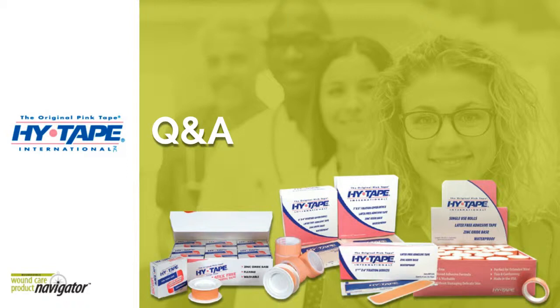Should HyTape be used with ostomy products that are able to adhere to skin on their own? Well, in a lot of cases, it's not necessarily needed, but in some cases where exercise or activity or even swimming is going to occur, it adds an extra layer of protection and security.